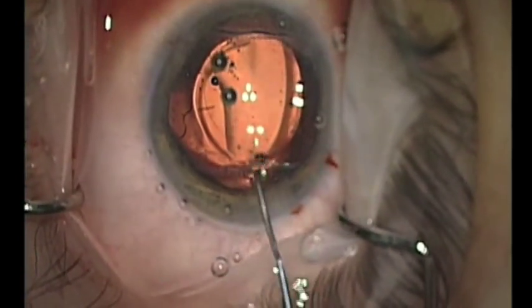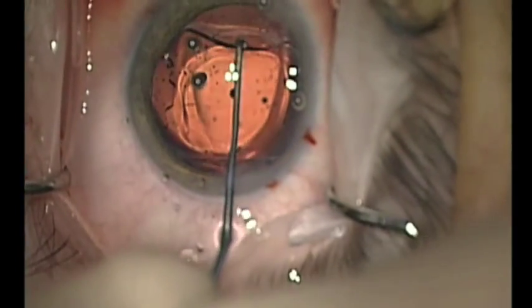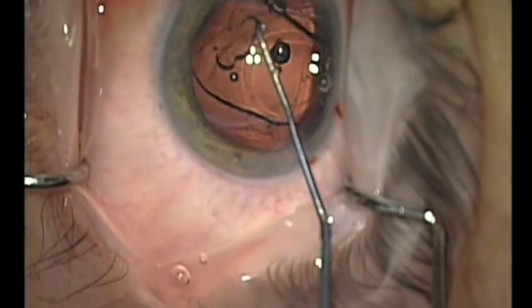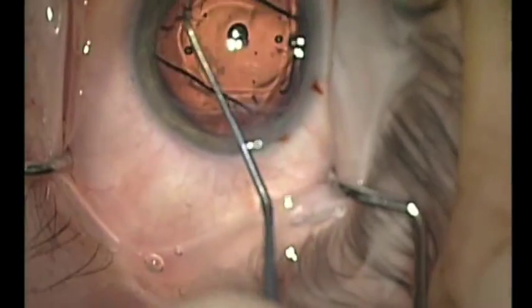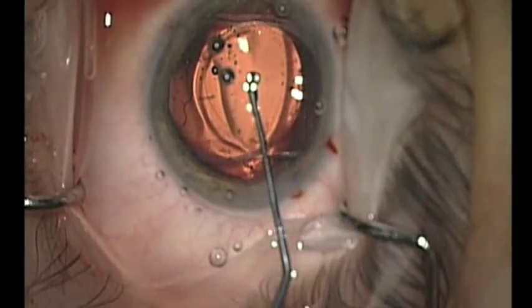The mushroom tip is ideally configured in order to facilitate explantation of the lens, which here I entitle mushroom tip and flip.